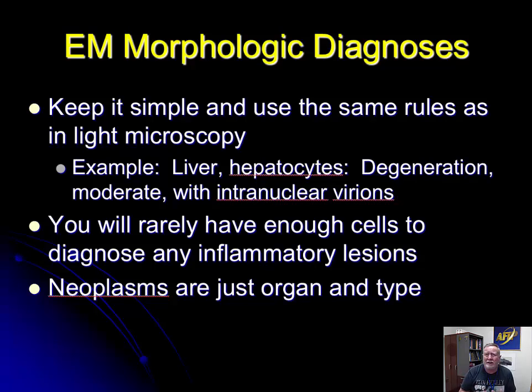Misdiagnoses are a lot more common than non-diagnoses in EM. I generally try not to overinterpret. And people will say, well, why did I bring it to you? That's so obvious. Well, because I don't want to make the wrong diagnosis. I've made a lot of them on EM over the years, and I don't want to make a diagnosis that's based on something that I really shouldn't be looking at.